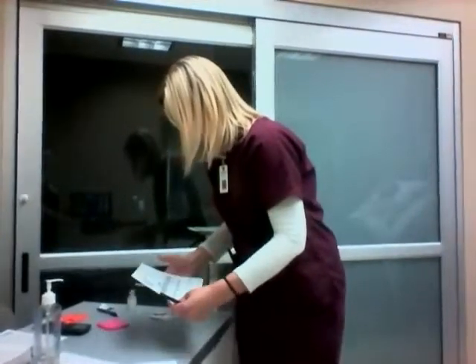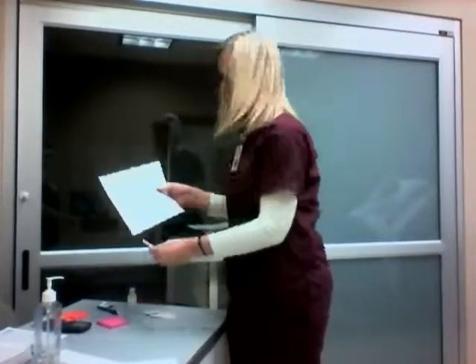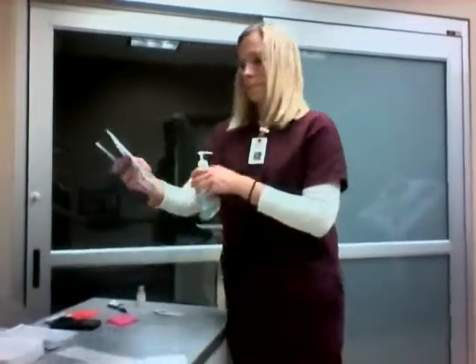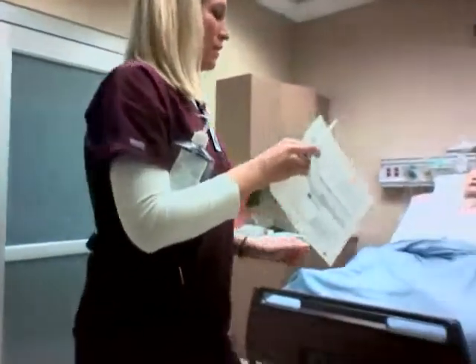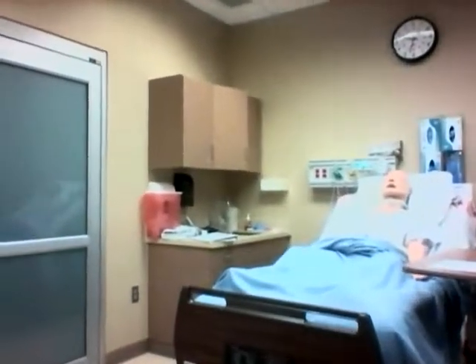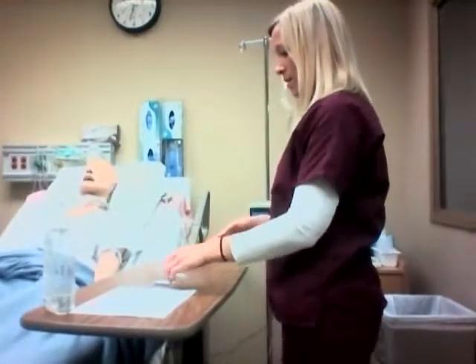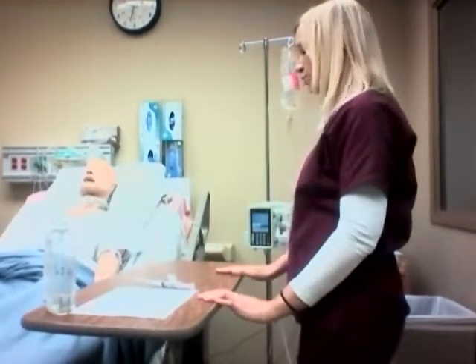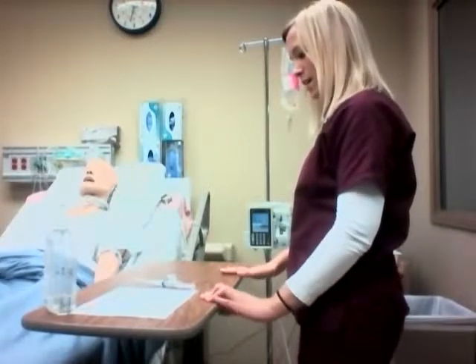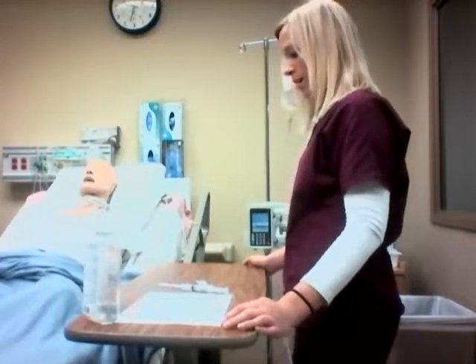All right, so now I am going to go into the patient's room, and we're going to give this IV stat dose through his IV. So we'll go and see Mrs. Smith. Hi, Mrs. Smith. My name is Elise, and I'm going to be your nurse for this shift, and I just have a medication here called Cardizem. This medication is going to help maintain the reduction in your heart rate, and it's used for patients with atrial fibrillation, which is why you're in the hospital right now.